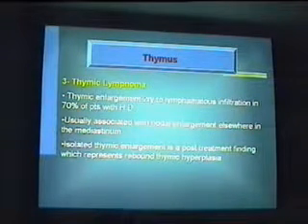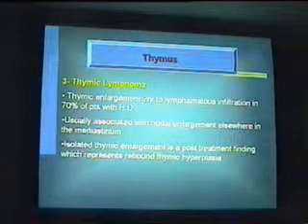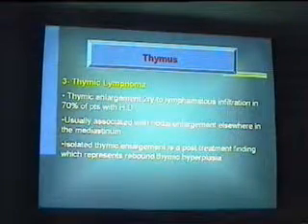اوكي ودي نقطة مهمة قوي عشان انا دايما لما بدي المحاضرة دي بدي الاكزامبل ده ان انا مرة وقعت في التراب ده.